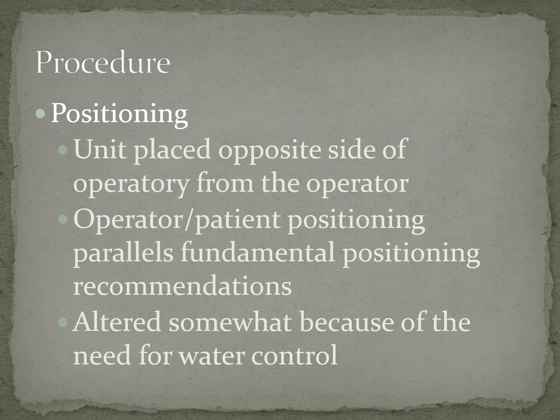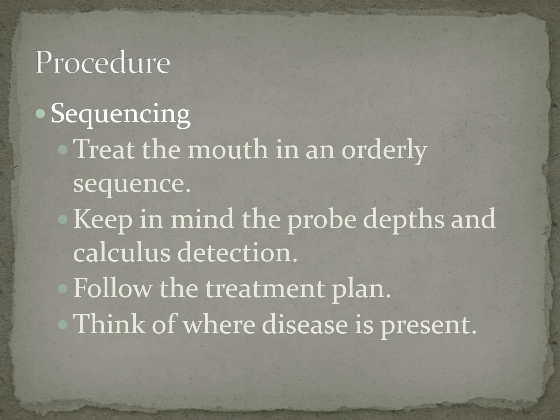Okay, so positioning. The unit is going to be placed on the opposite side of the operator. The operator and patient positioning is going to be very similar to your fundamental positioning. So you're going to sit in the same place as you would to instrument typically. It can be altered a little bit because the instrument is doing the work and you're not. But in general, we're going to use the same fundamental positions. It's going to be altered a little bit too because of that water control, so you may need to sit your patient up just a little bit. Okay. Come up with a sequence.